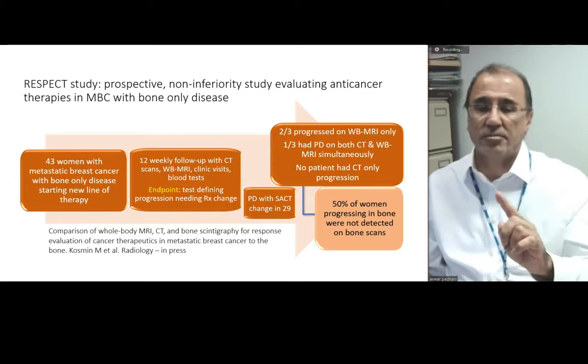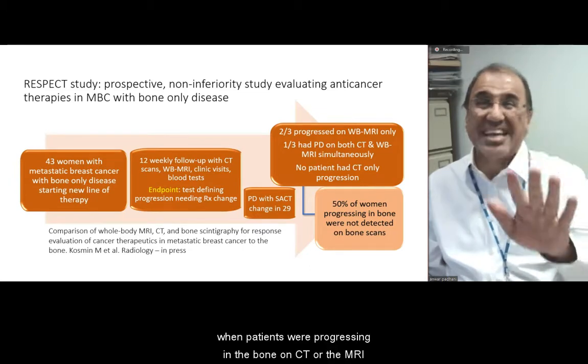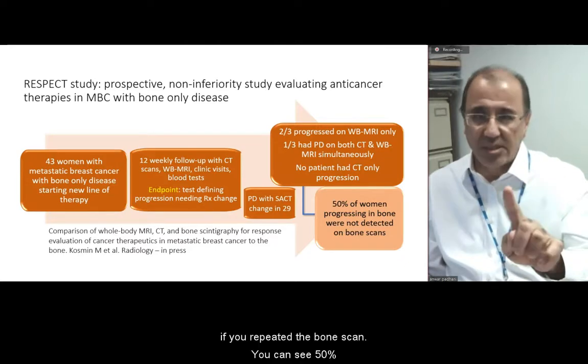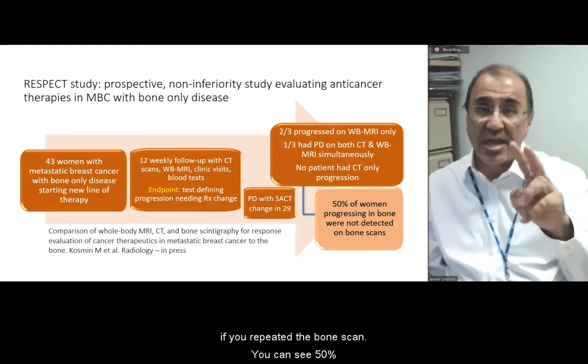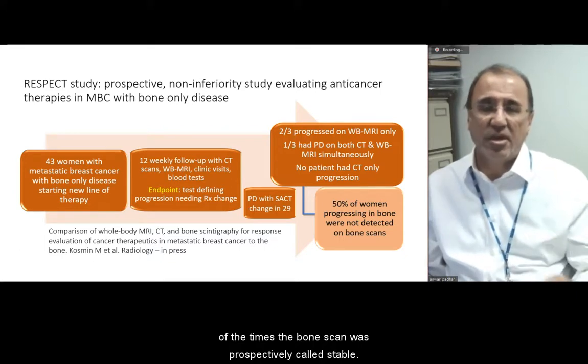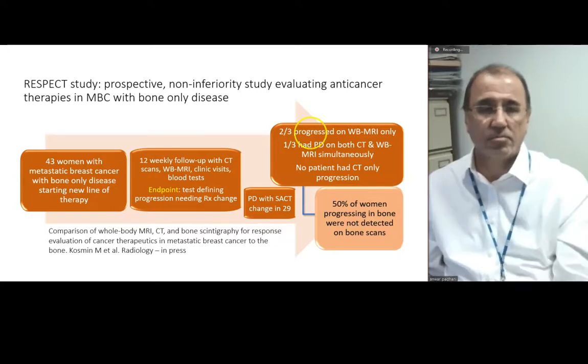Not one patient. And in fact, when patients were progressing in the bones on CT or the whole body MRI, if you repeated the bone scan, you can see 50% of the times the bone scan was prospectively called stable. Interesting.